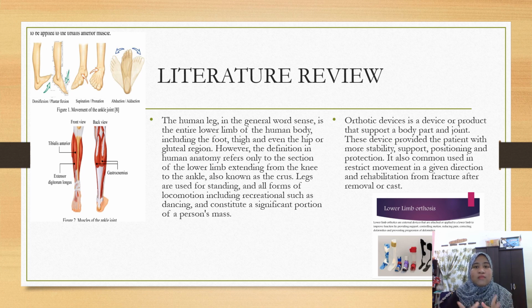Okay. After that, I have also learned there are several devices for helping the dorsiflexion of foot drop patients to use as support. So first, orthotic device.